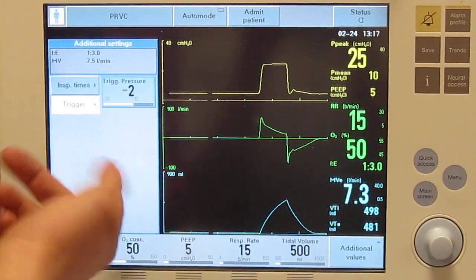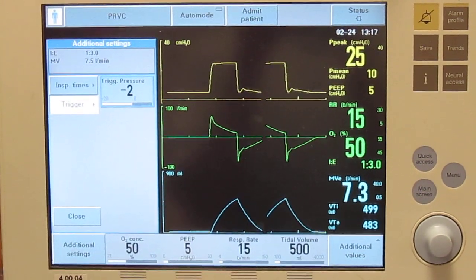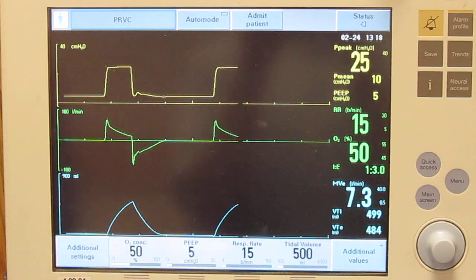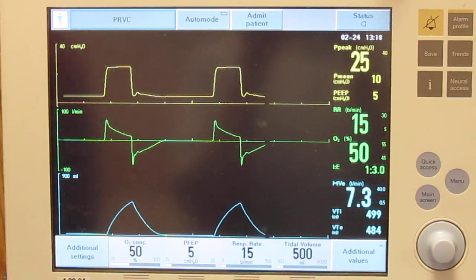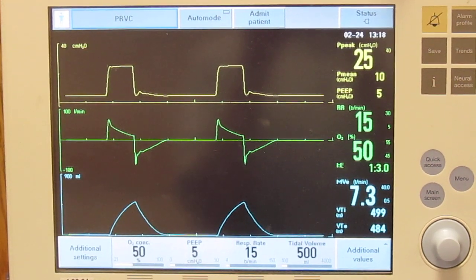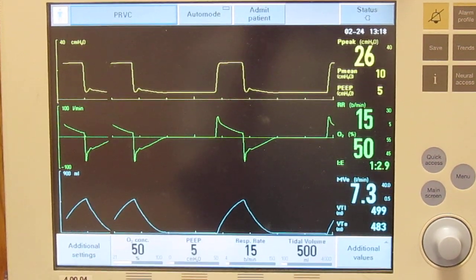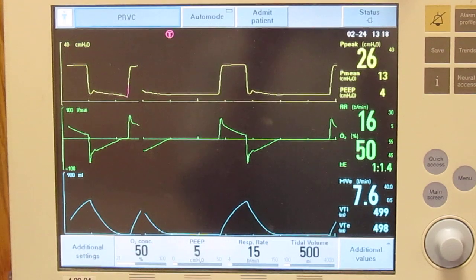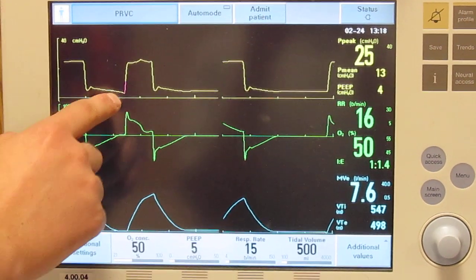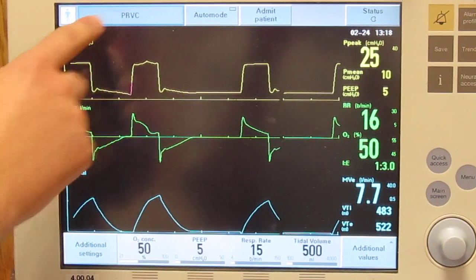We are in pressure right now. The sensitivity is set at minus two, so we will see what a breath looks like with that once it comes back around. So there's a mandatory breath, and there's a patient-triggered breath. You see it dropped a little.